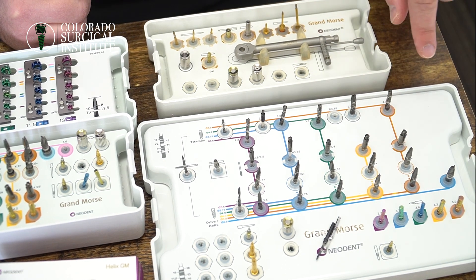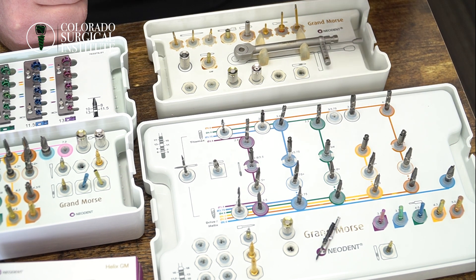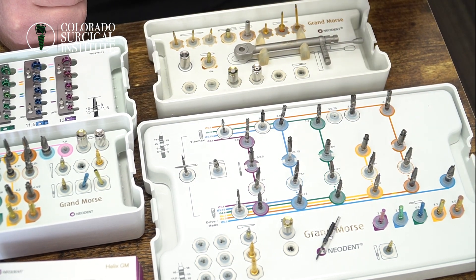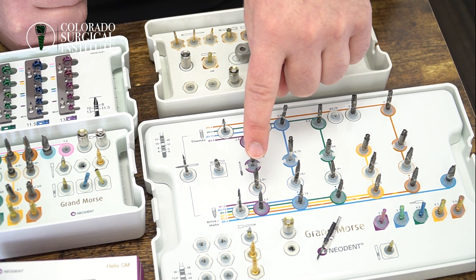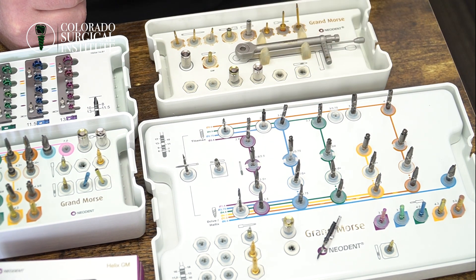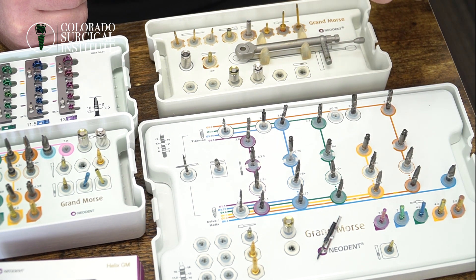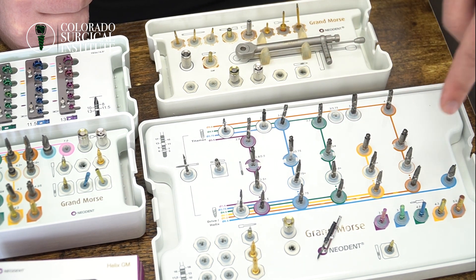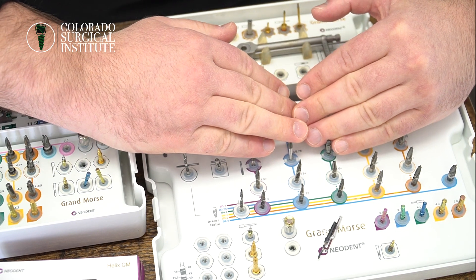The row above is the plus size burrs. The plus size burrs change the width of the osteotomy. The regular burrs undersize the osteotomy by one millimeter. If you have very, very dense bone, you can upsize the burr and add another 0.3 millimeters to your osteotomy — really useful for D1 or D2 bone. So for the majority of the time you're going to use the regular row; the plus size burrs come in for D1 or D2. In a lot of our kits, we don't even have the plus burrs because we don't use them that often.